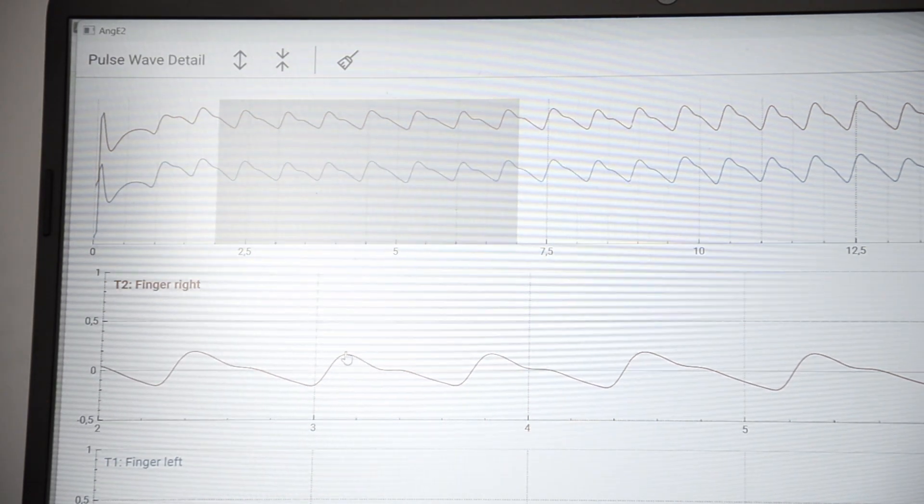In order to calculate the pulse wave velocity, you have to set markers on the peak and the dicrotic wave of the pulse wave.